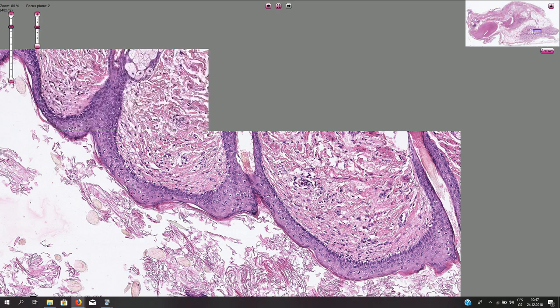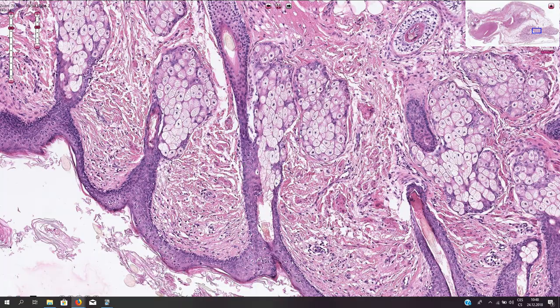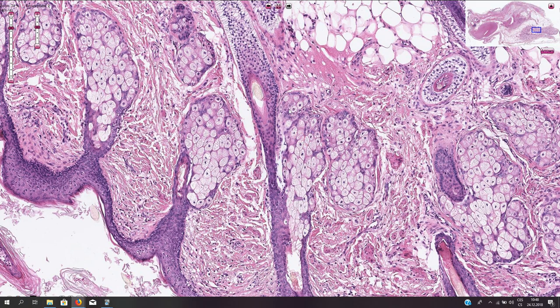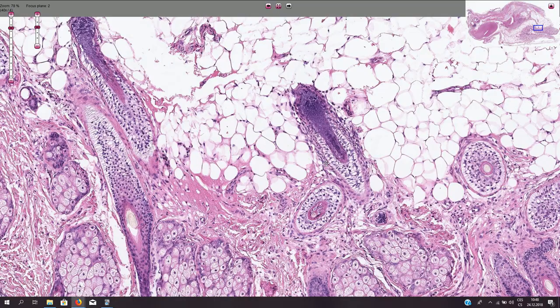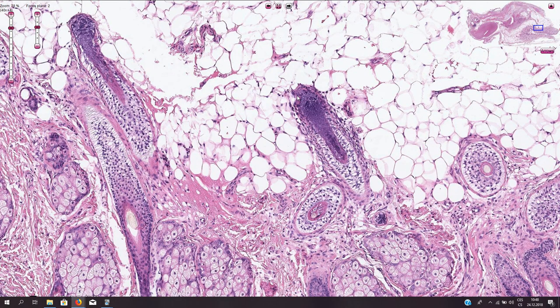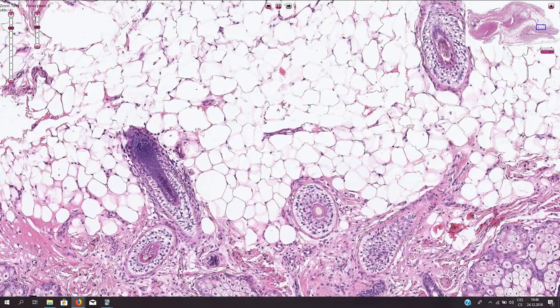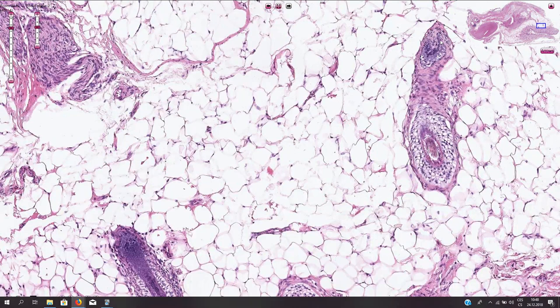Here we have multiple hair follicles with sebaceous glands. Here we see the basal part of the hair follicle with the papillary mesenchymal body, or the hair bulb. Here we have the outer root sheath cells with this clear cytoplasm. This is another papillary mesenchymal body, or the basal part of the hair follicle.